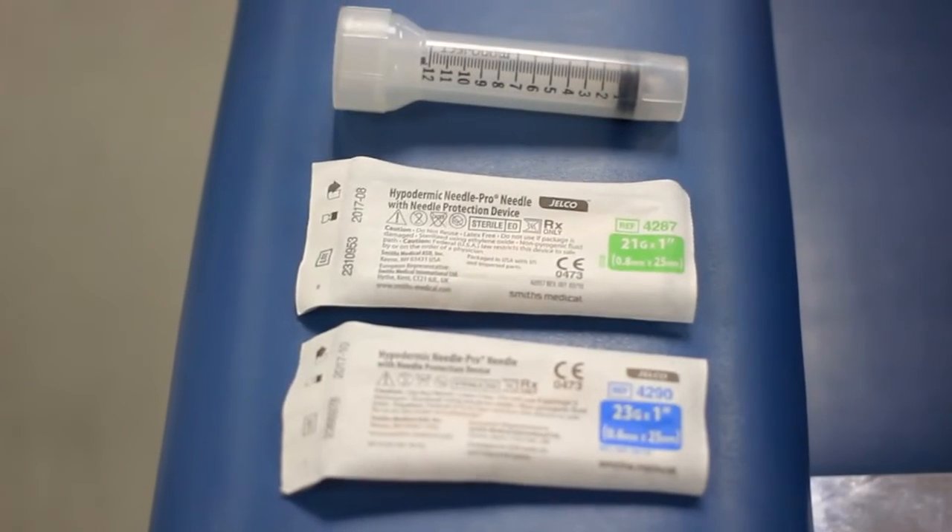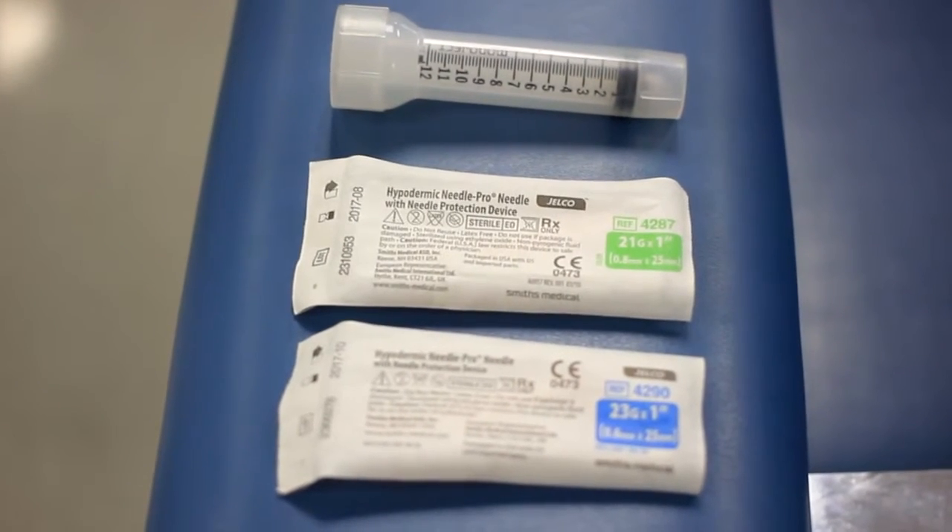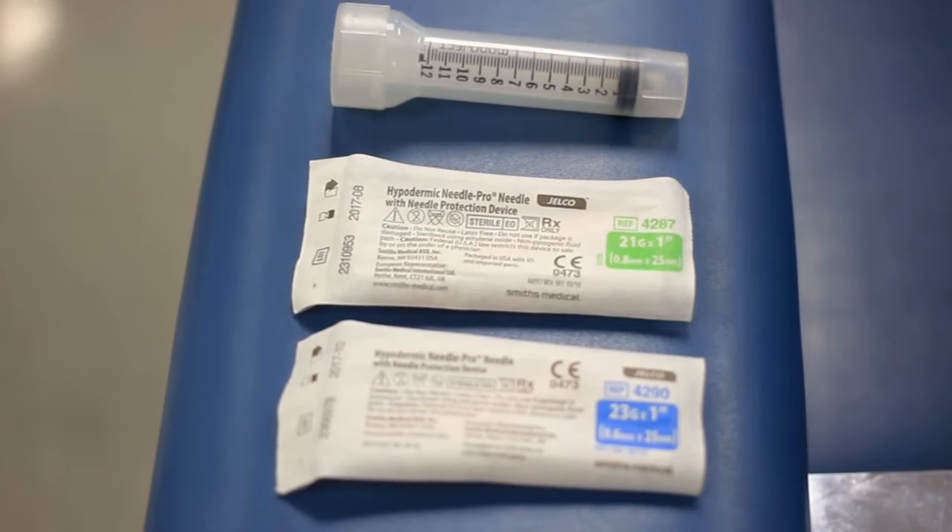There are many equipment options available when utilizing a syringe for sample collection. This video will review the basic equipment utilized in standard syringe collection.